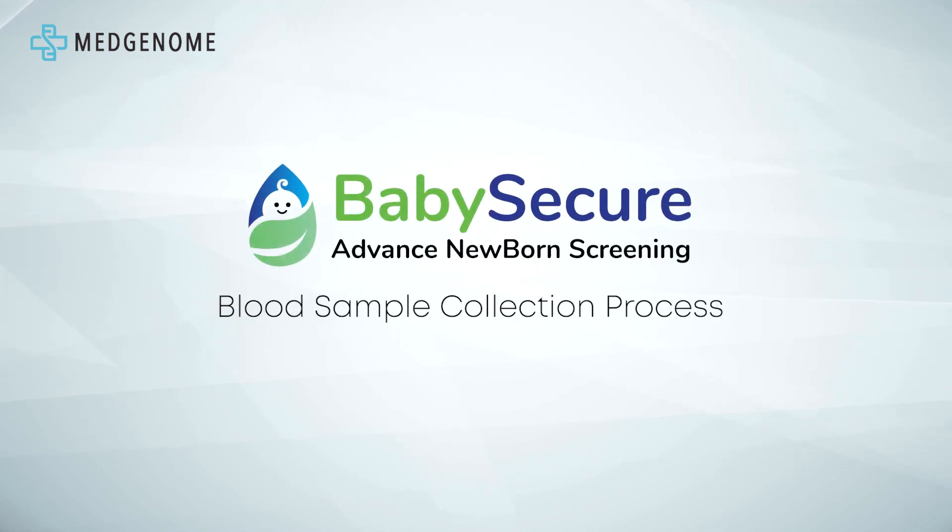This brief instructional video demonstrates the proper technique for collecting blood samples for the Baby Secure Advanced Newborn Screening Test. It offers valuable tips for effective collection and highlights common mistakes to avoid during the process.